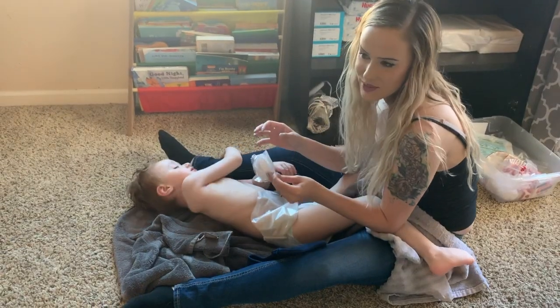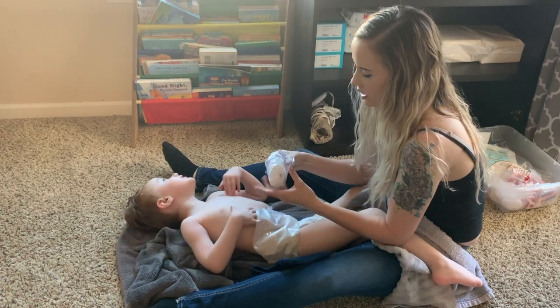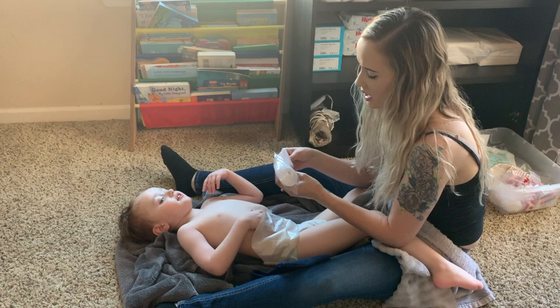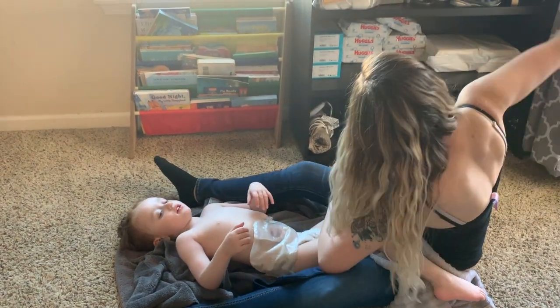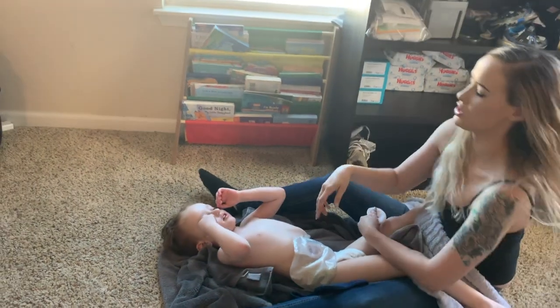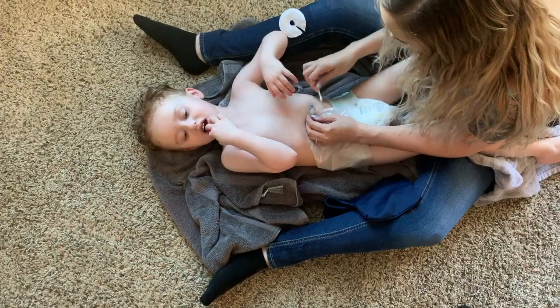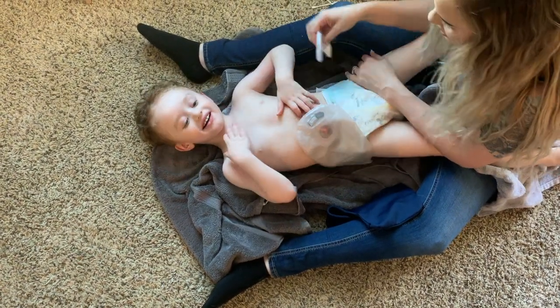So we usually have really cool G-tube covers. I have them, I just don't know where they are right now. Probably in the washer. We have millions of them, and we literally just bought like 25 of these regular G-tube covers because if you know anything about G-tubes, they really help prevent any of the gunk. So I just clean the skin because it doesn't get off all the gunk even though you just rinsed it.